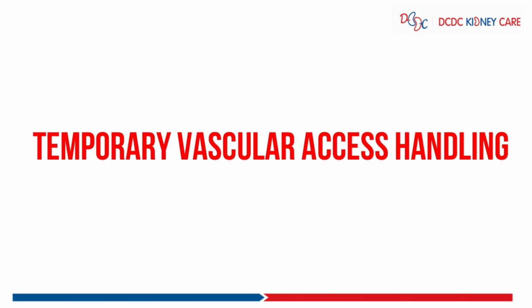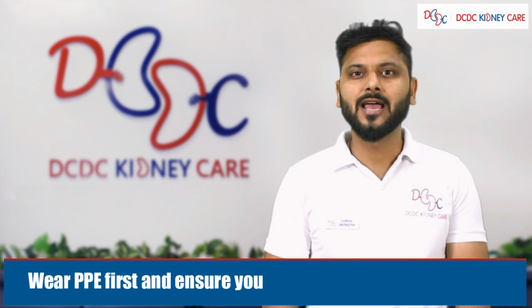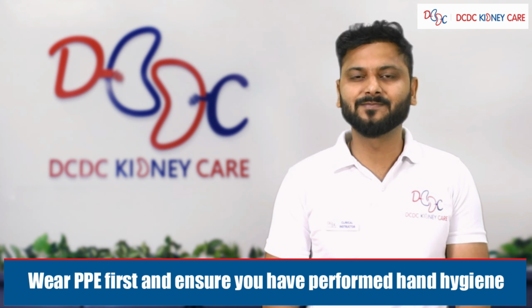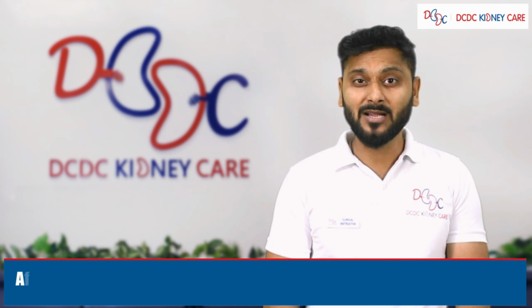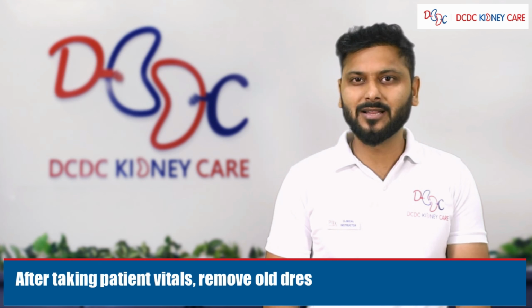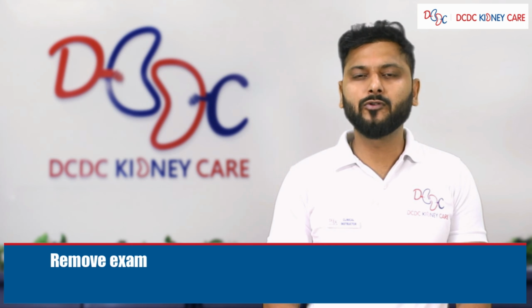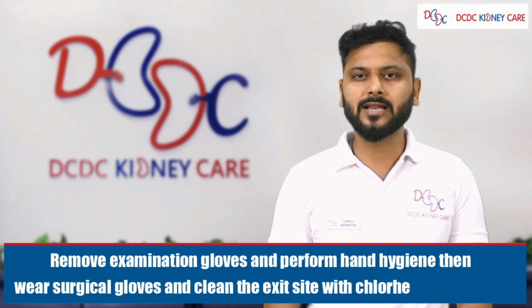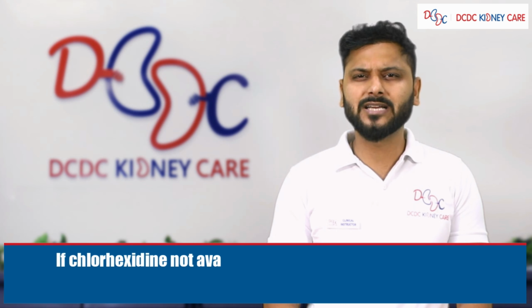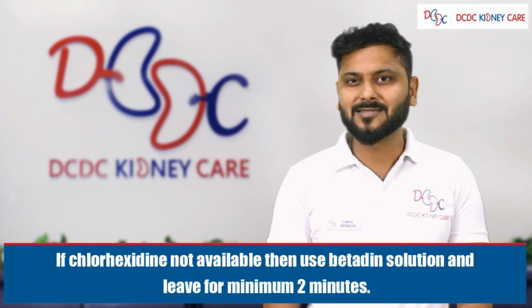Temporary vascular access handling. Internal jugular catheter HD initiation. First, wear PPE and ensure you have performed hand hygiene. Second, bring all the necessary consumables for catheter handling. Third, after taking patient's vitals, remove old dressing with examination gloves. Fourth, remove examination gloves and perform hand hygiene, then wear surgical gloves and clean the exit site with chlorhexidine solution. Fifth, if chlorhexidine is not available, then use betadine solution and leave for minimum 2 minutes.